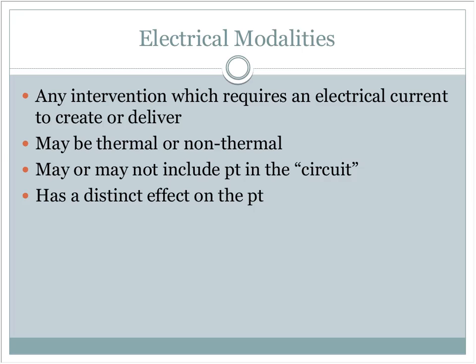So what is an electrical modality? Well, an electrical modality is any intervention which requires an electrical current to create or deliver. This can be by plugging the unit into a wall socket, or it can be utilizing a battery. They may or may not be thermal in nature, meaning generating heat. Not all electrical modalities generate heat. Obviously, ultrasound is a unit that is designed to create a heating effect, but electrical stimulation for muscle contraction or TENS is not.